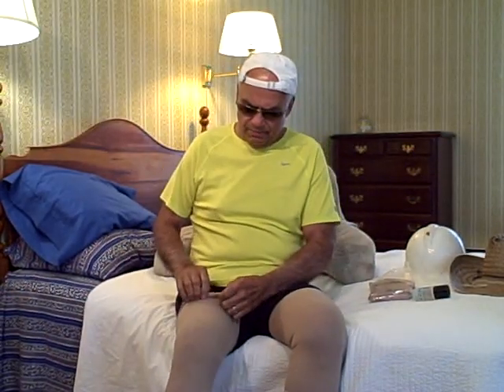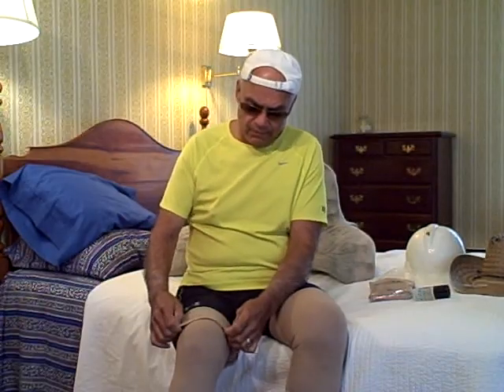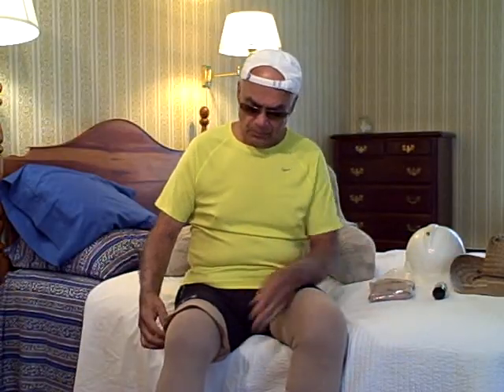Here's how you do it: take your stocking and fold it back. You take your It Stays — it's a roller application — and you just roll it around the top edge of the stocking. Then make another circle around your leg. Once you do that, put your fingers under the cuff, pull it back, and you are good to go. You don't have to let each side dry. It will stay and last all day long.